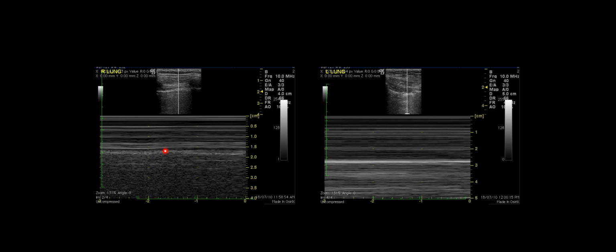So this is the seashore sign, versus when there's a pneumothorax, the air just reflects evenly at this tissue and reverberates. And all we see is this endless series of evenly spaced things, rather than seeing that visceral pleura on top of the lung. And so we see this series of straight lines here, and this is likened to a barcode or a stratosphere sign.